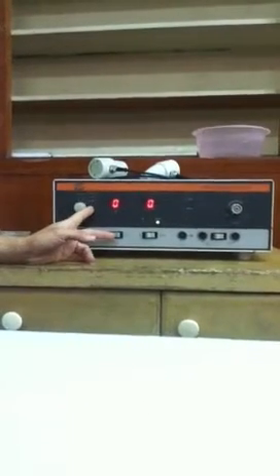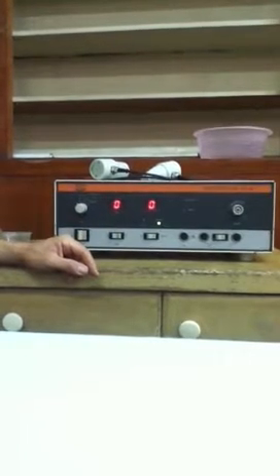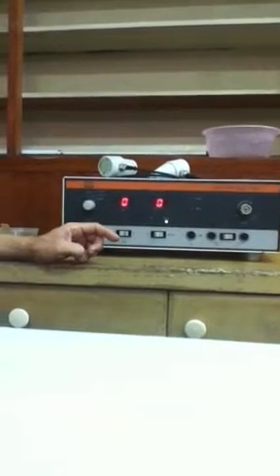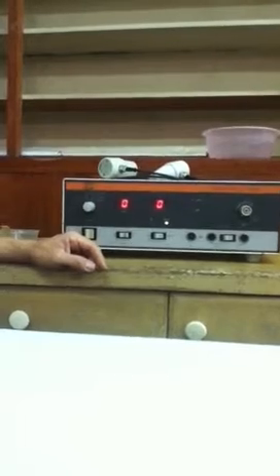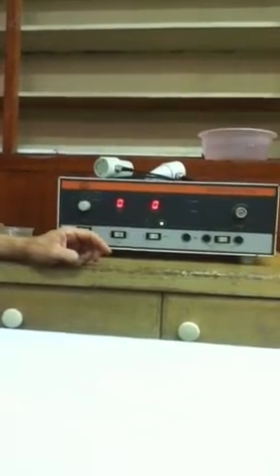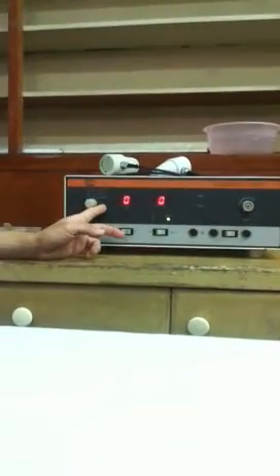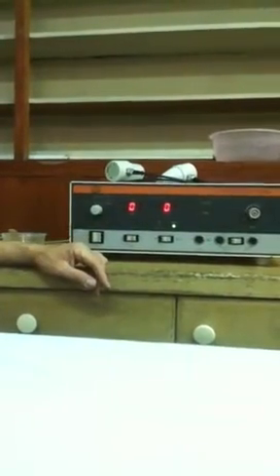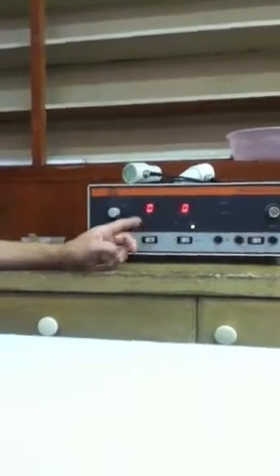And this is in terms of milliseconds. If you have a ratio of 2 is to 8, it is on for 2 milliseconds and off for 8 milliseconds. If you have 1 is to 9, then 1 millisecond on, 9 milliseconds off. Each cycle is 10 milliseconds. If you have 0.5 is to 9.5, that means 0.5 millisecond on, 9.5 milliseconds off.